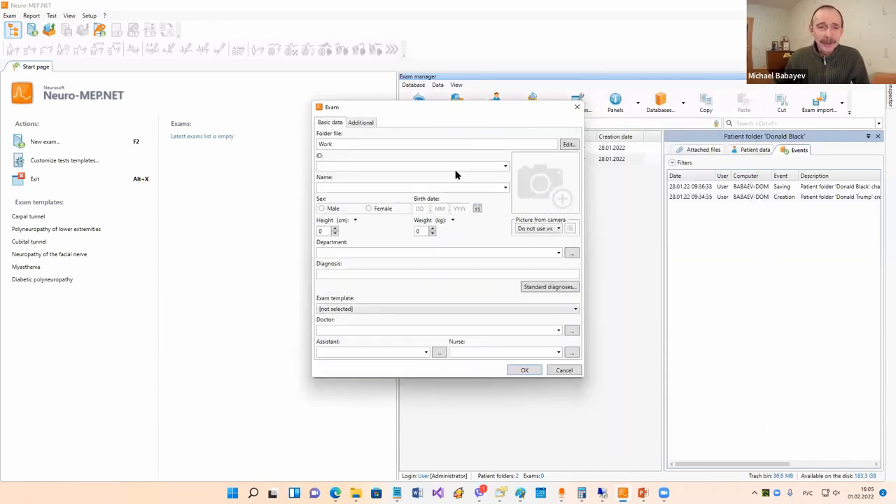It can be very small or very big. Here we type the patient name. Then I press the Tab key and go to patient sex. I can toggle patient sex with the Space key. Then I press Tab twice and input the birth date. For birth date, you only need to type six digits - for example 0 6 11 67 - then press Tab. It's ready.